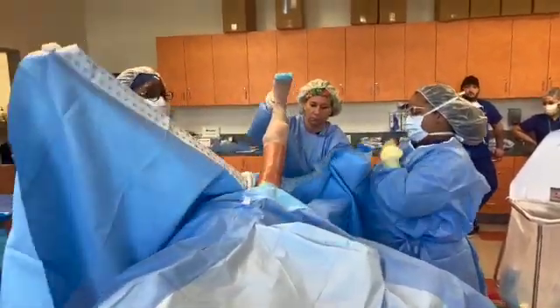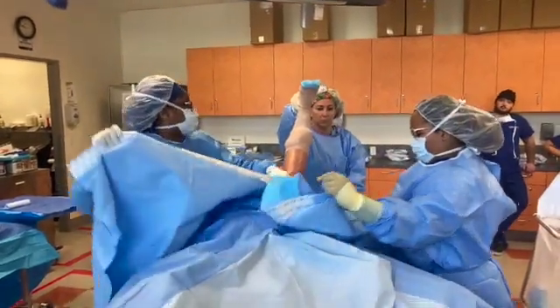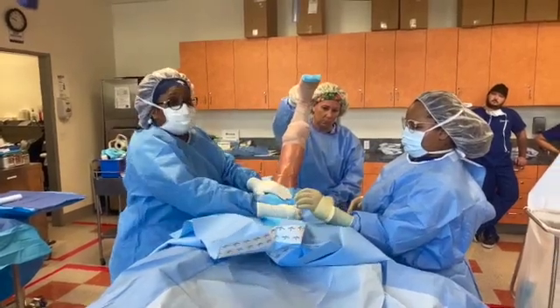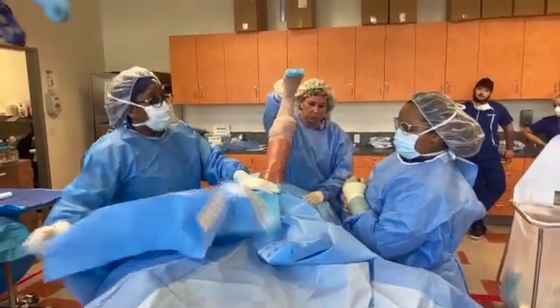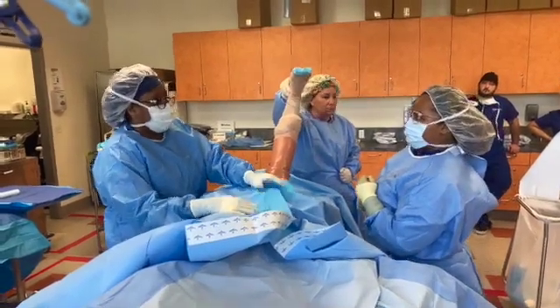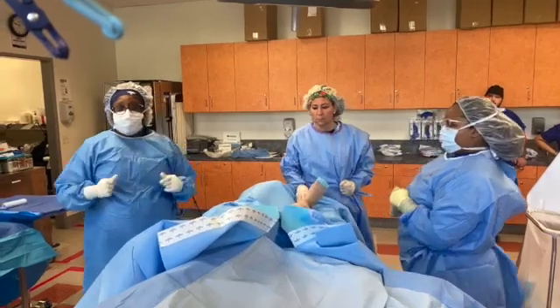So when we say kiss, that means sticky to sticky. That's kissing. When we say cross, that means one goes down, the other one goes over. That's the other way to do this particular drape. Okay? Kiss or cross. Are we kissing or are we crossing? All right? Thank you, Miss Steve. Thank you, Miss Bree.